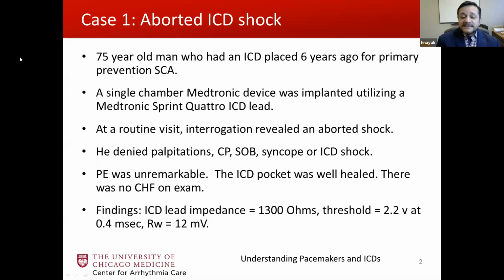So this first case is going to feel very similar to you. This was mentioned by Dr. Singh. This is a 75-year-old man who had an ICD placed 6 years ago for primary prevention of sudden cardiac arrest. A single chamber Medtronic device was implanted utilizing a Medtronic Sprint Quattro ICD lead. At a routine visit, interrogation revealed an aborted shock. He denied any palpitations, any symptoms, or a true ICD shock. Physical examination was unremarkable. The pocket was well healed. There was no heart failure on exam.